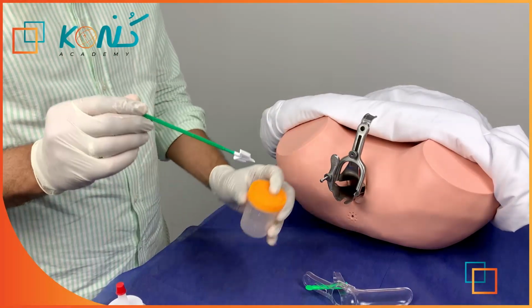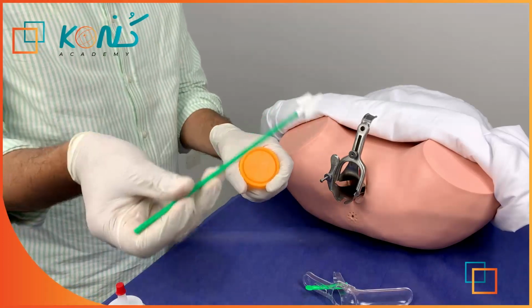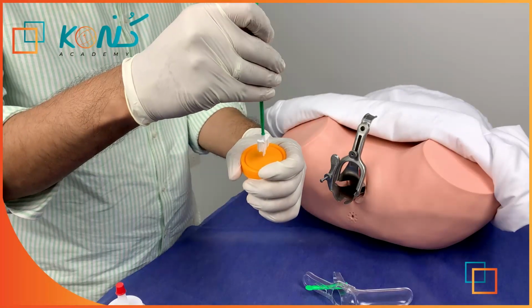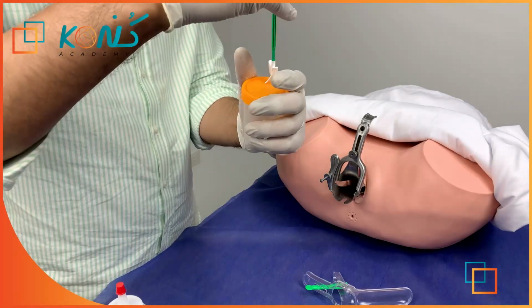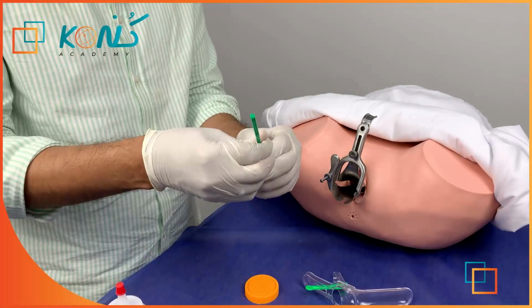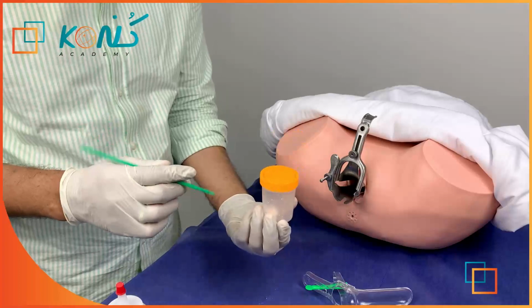SurePath is a container cup like this with a hole on its top. You will put the top of the brush, this white part I mean, through the hole, and after putting it through the hole, you will rotate the brush like this. By making this rotation, you let this white part fall down into the container. We are naming this the SurePath technique.